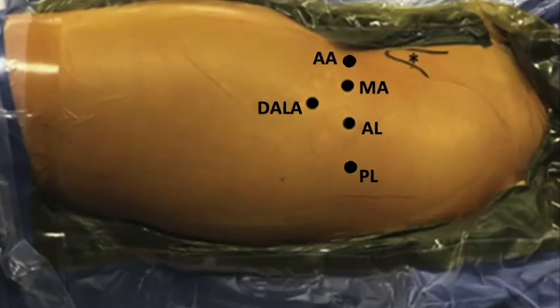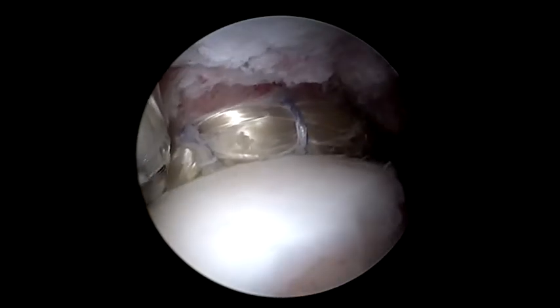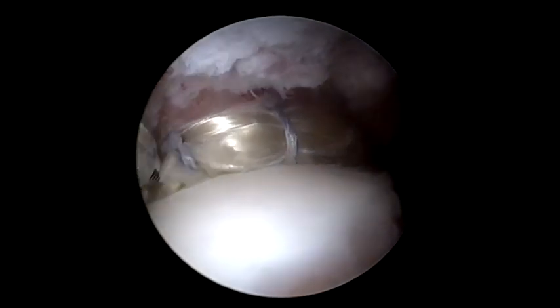The patient's projected portals were identified in the mid-anterior, anterolateral, posterolateral, distal anterolateral accessory, as well as the accessory anterior areas as shown. During diagnostic arthroscopy, a large degenerative full-thickness acetabular labral tear can be seen with adjacent chondrolabral damage as seen. A circumferential labral reconstruction was chosen to perform reconstitution of the labral seal as seen here.